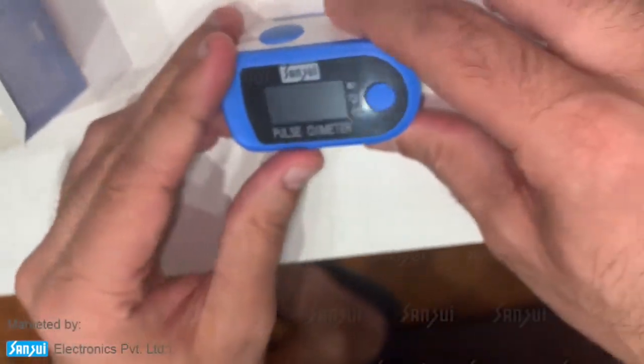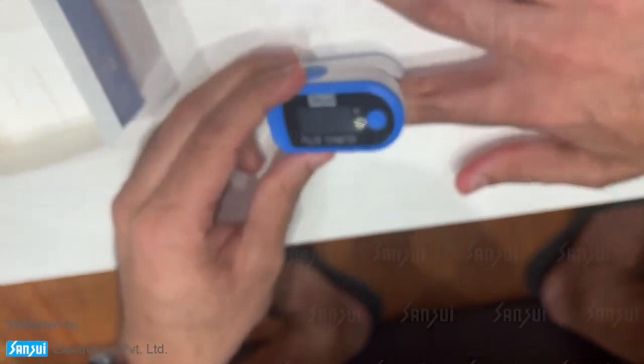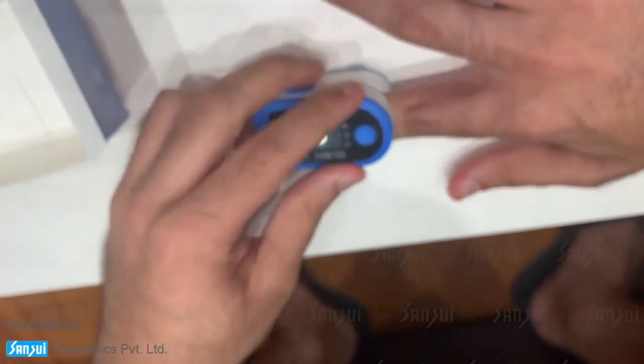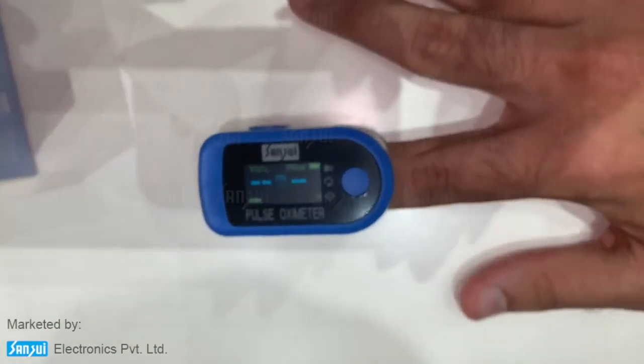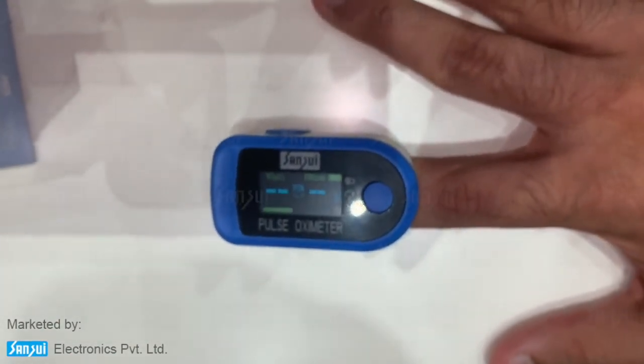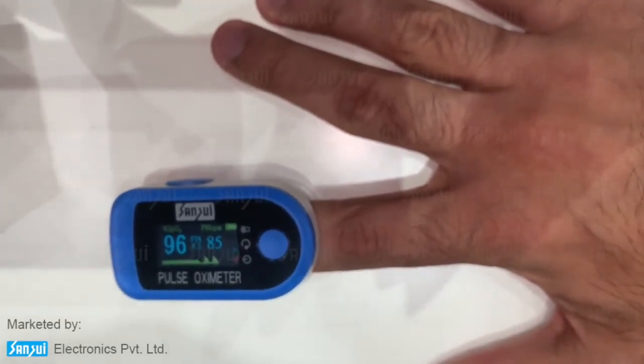To use it, I'm going to put my finger inside the oximeter. Once it is secured all the way inside, I'll press the button to start it. You'll see it has started. Make sure it is on a flat surface so the reading is not hampered and there's no movement.